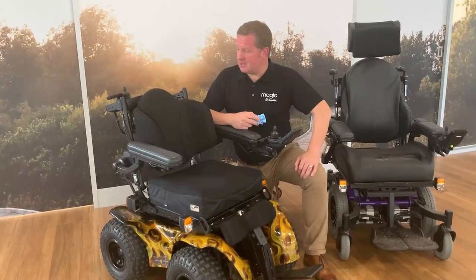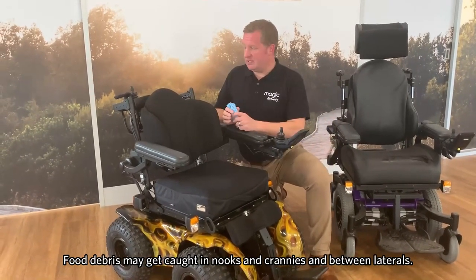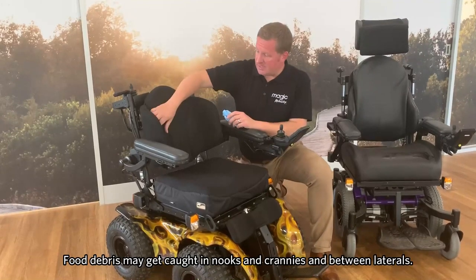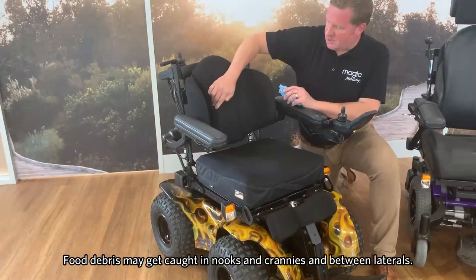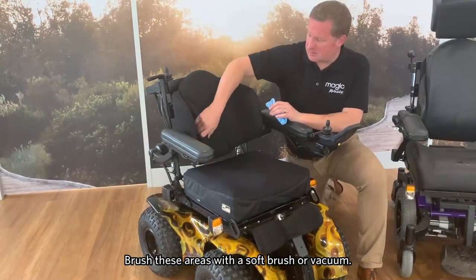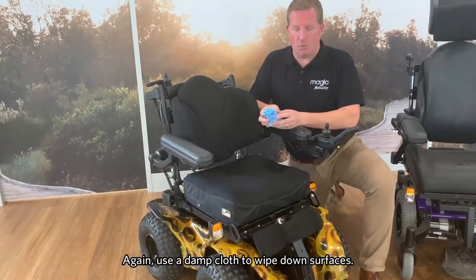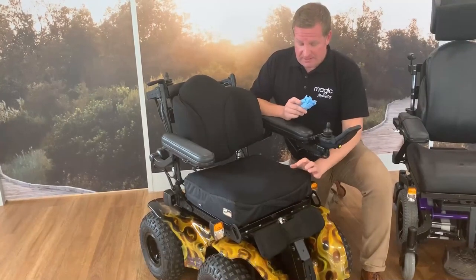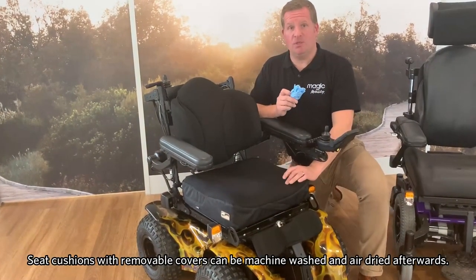When looking at our seating systems with fabric covers, be mindful that bits of food debris can get caught in some of the nooks and crannies of the chair — for example between the laterals. You can either brush those down with a soft brush or use a vacuum to suck away the debris. Then just use a damp cloth to wipe down the surfaces.